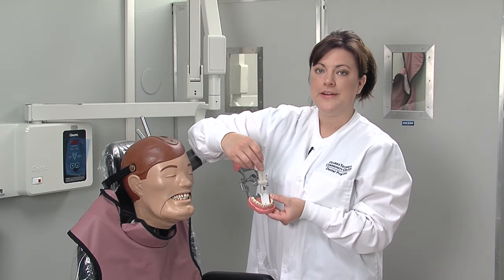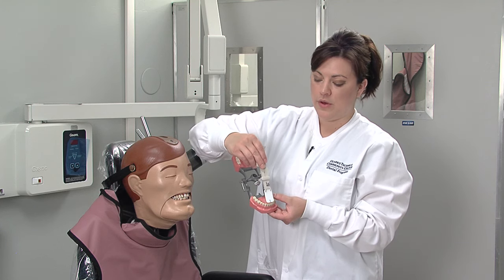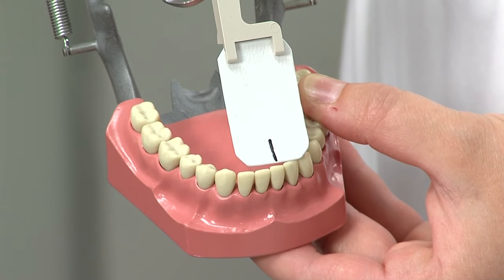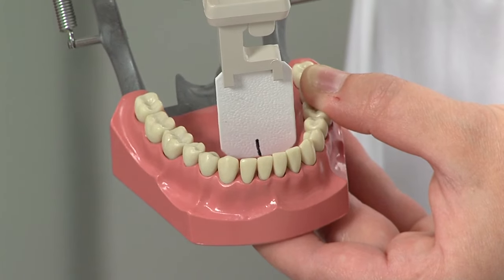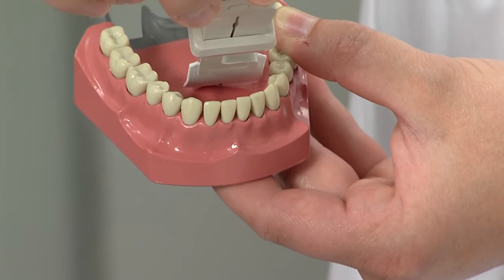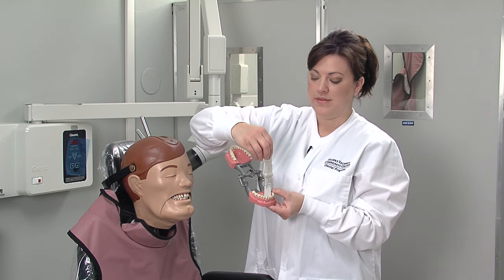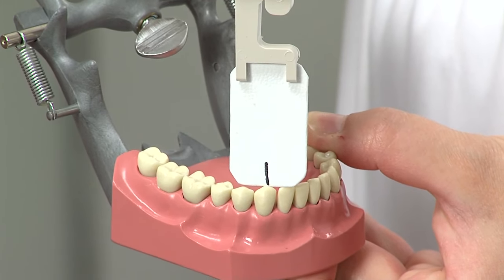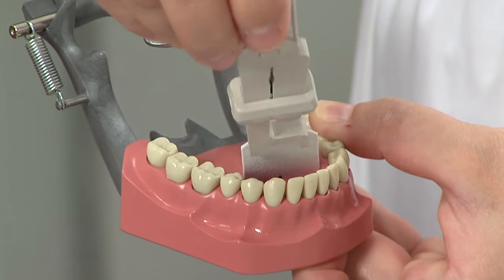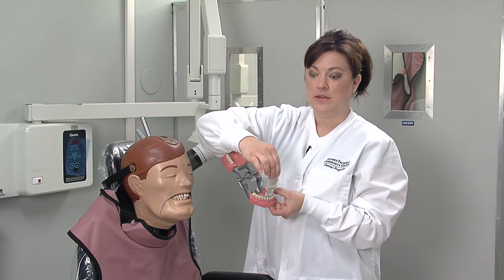For the mandibular anteriors, remember you're going to get the centrals and laterals all on one radiograph. We're going to line up the center of the film at the approximate midline to get both centrals and laterals on one film, then lay the film in the patient's mouth as close to the lingual surface as possible and have them close down. To do the canines on the mandible, we would simply move our line over and have it positioned at the middle of the canine, and have the patient bite down. That would be all of our mandibular anterior shots.